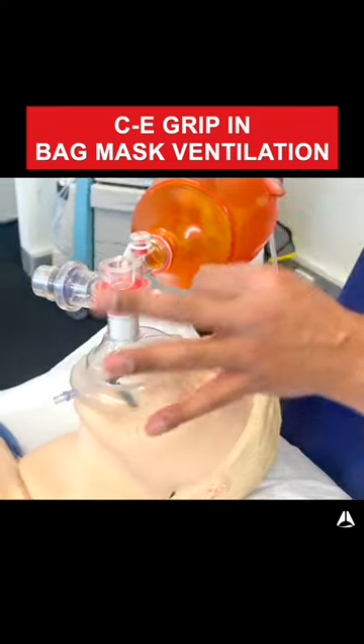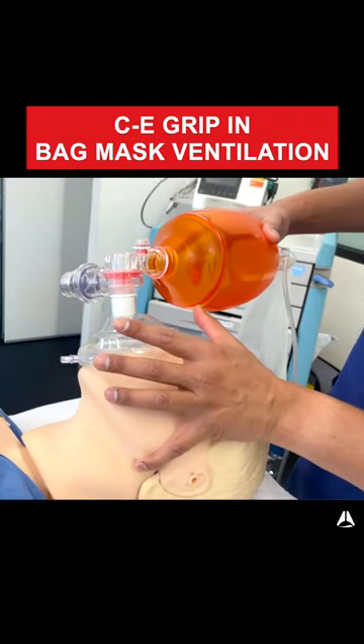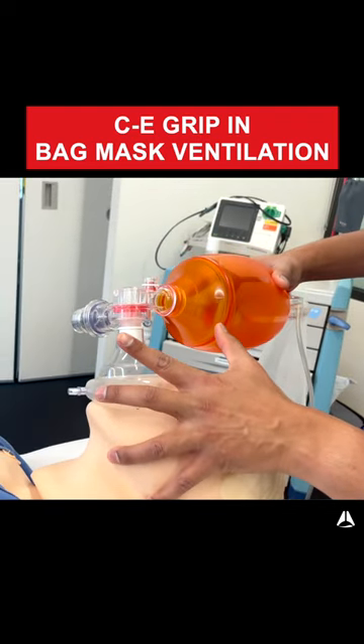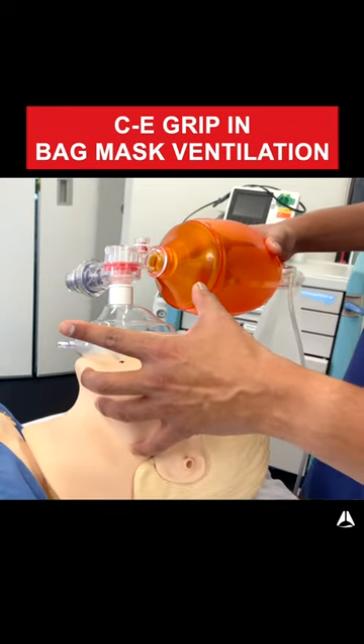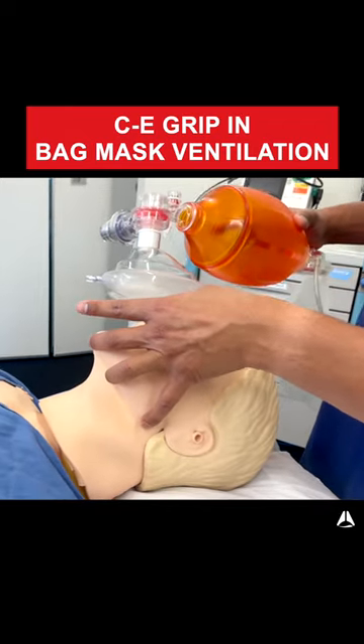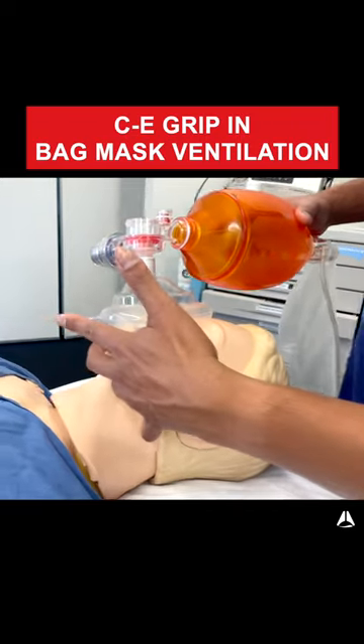My E grip goes here — I've got my little finger just at the angle of the jaw, then my ring finger just along the side of the bone, and then finally the middle finger at the chin. One important thing to note is that these fingers aren't pushing into the soft tissue; they're really just around the bone.